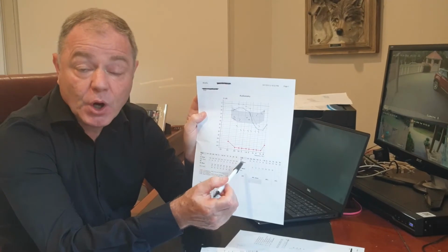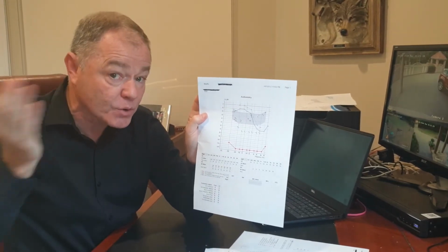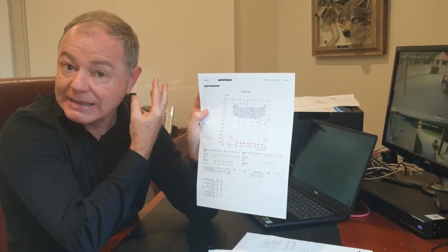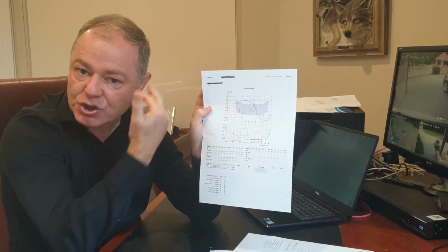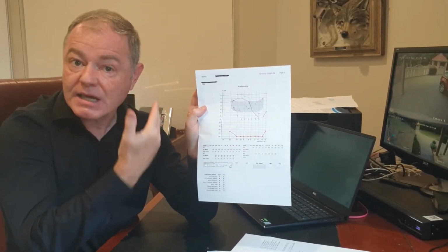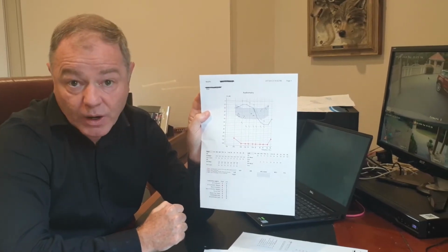They could use what we call a bicross, which is where in the right ear we would put half a hearing aid, which would be a microphone to pick the sound up from the right hand side, and then a transmitter that transmits the sound to a hearing aid in the left ear. So the left ear does all of the processing, all of the hearing, but you'll be able to hear from both sides of your body. And often people opt for that. And that can work quite effectively.